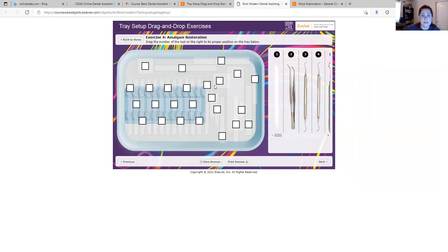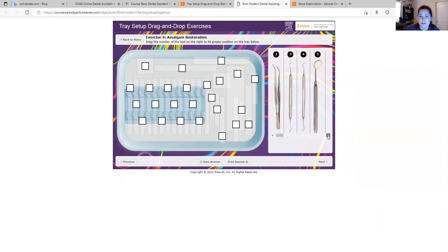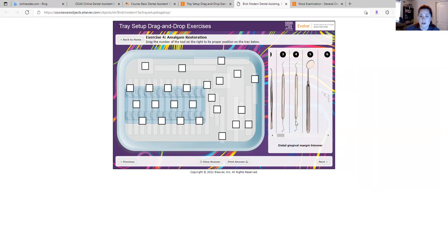So of course this is your tray and over here is what you'll need for the procedure. These are all different types of instruments. And if you put your mouse over them, it tells you the name of it, which is fantastic.